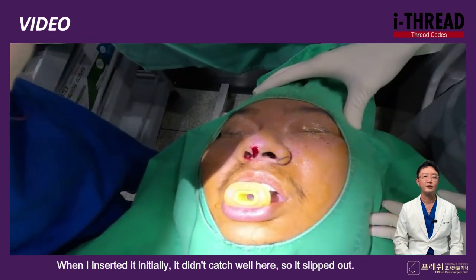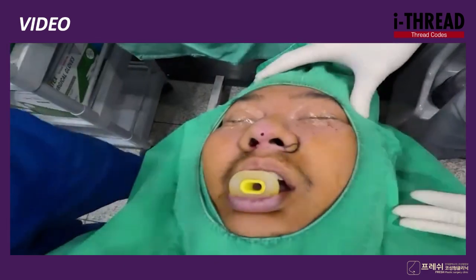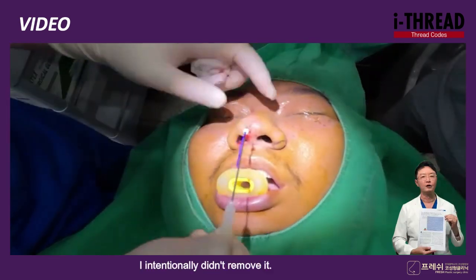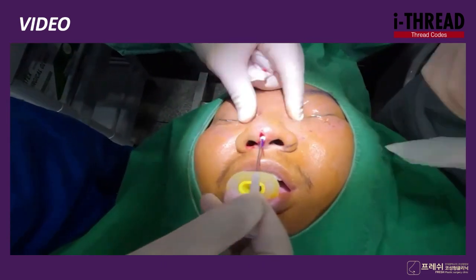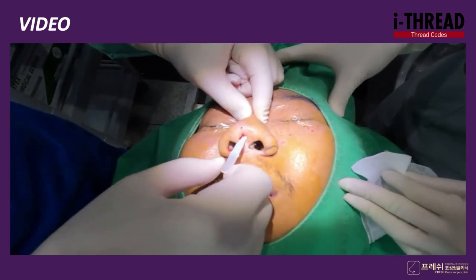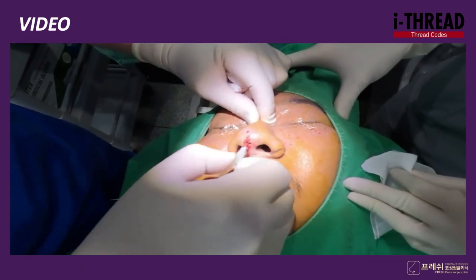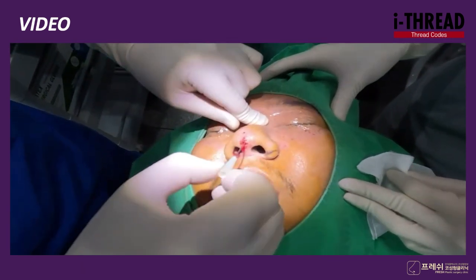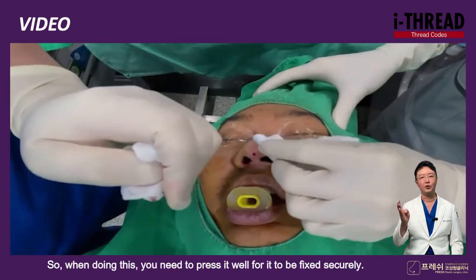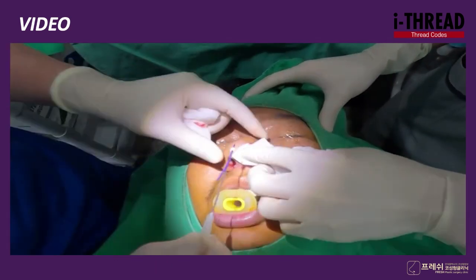When I inserted it initially, it didn't catch well here, so it slipped out. I intentionally didn't remove it. Even after removing the cap and pressing, it still slipped out. So, when doing this, you need to press it well for it to be fixed securely.